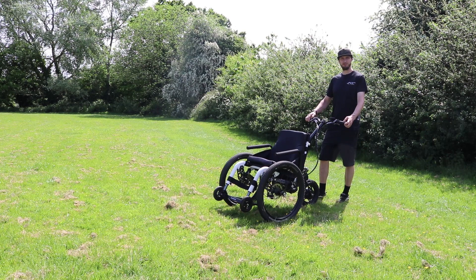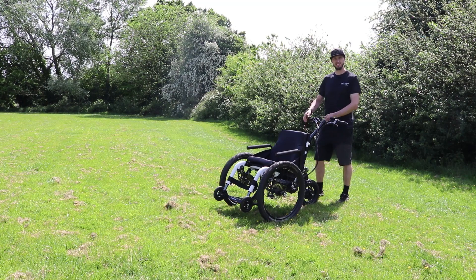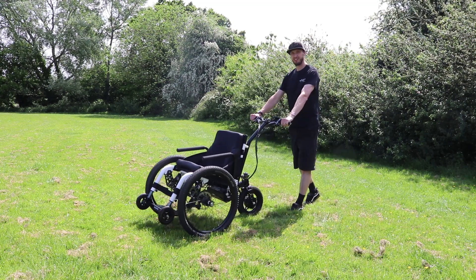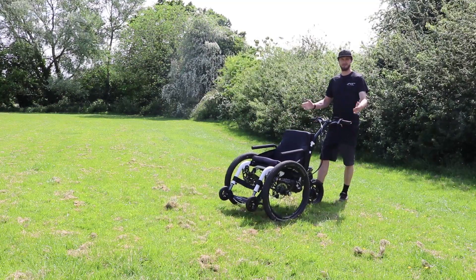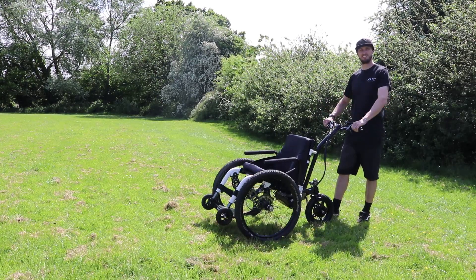When you're ready to go, simply release the parking brakes by pushing them down on both sides, and now you can just push forwards to go. To reverse, you simply pull the trike backwards, and that's as simple as it gets. To steer the trike, you simply push the handle to the side to start a turn.